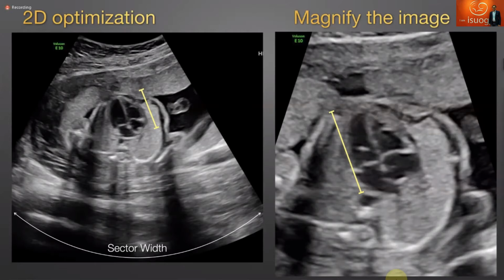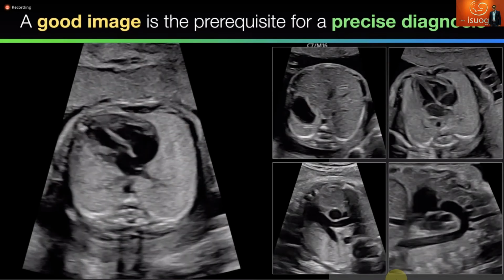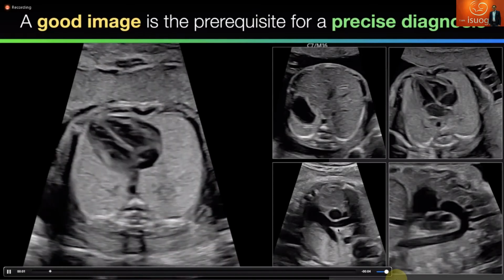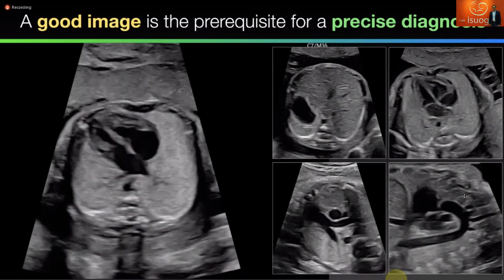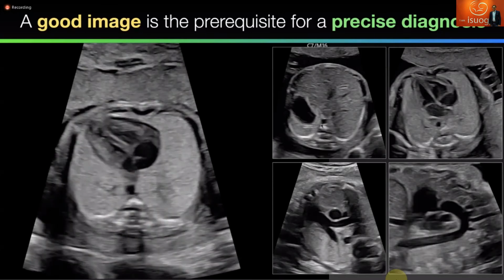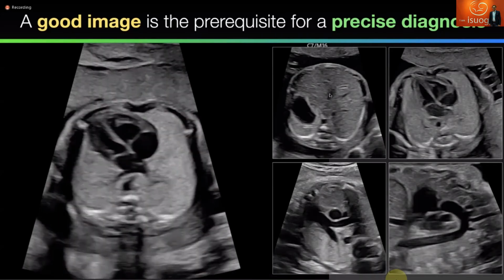I show you here, for example, with the new probe, the RM7 probe, the four-chamber view, and here the stomach, the four-chamber view, and the three-vessel view with the bifurcation of the pulmonary artery and the aortic arch, where you see clearly what's going on. You see even here the thymus and the diaphragm and the aorta. So please work on the picture, because a good image is the prerequisite of a precise diagnosis.